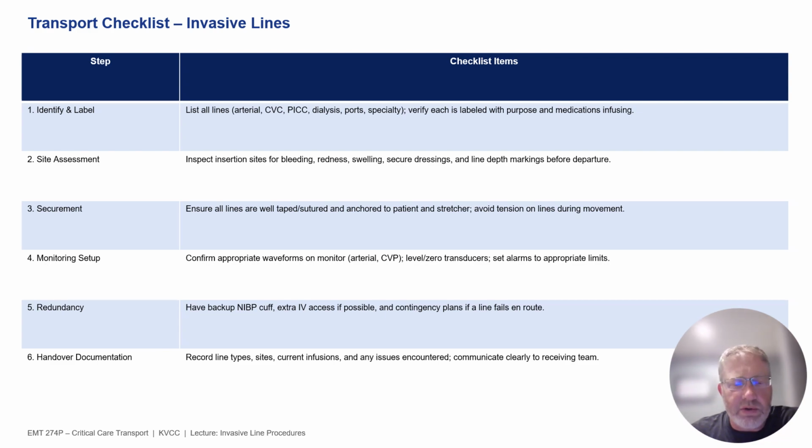Whenever you're transporting a patient that has invasive lines, try to make a checklist. That could really come in handy for you en route, especially when you're trying to manage multiple different areas and aspects of the patient's condition.